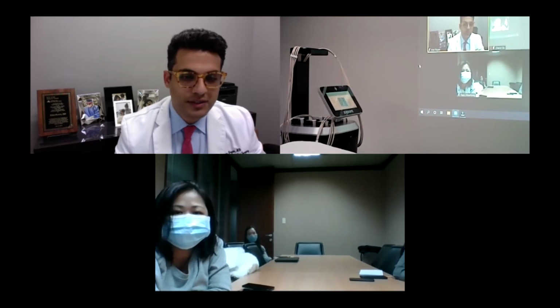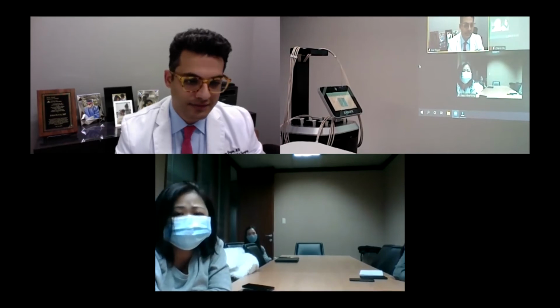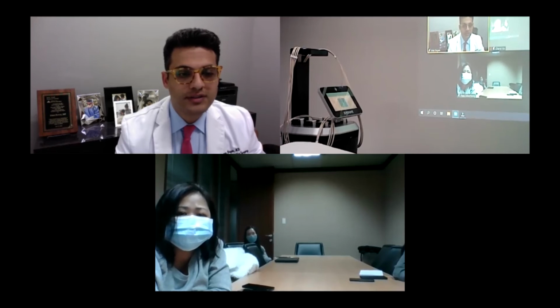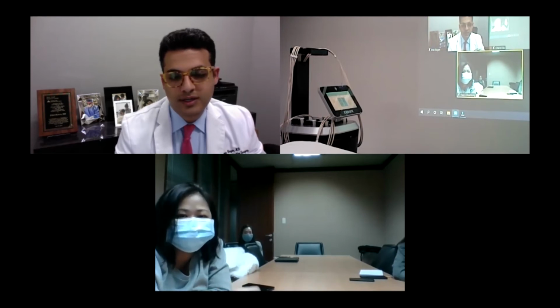That's a great question. So what I would say is, extreme stretch marks are basically a scar on the underside of the skin surface. A lot of people ask about cellulite and stretch marks. Cellulite I've seen improve significantly. Stretch marks, if they're very severe, will improve somewhat, but I wouldn't necessarily apply it to a patient that has severe stretch marks. I don't think there's any non-invasive option. Yeah, none yet. I'm hoping this would do it.